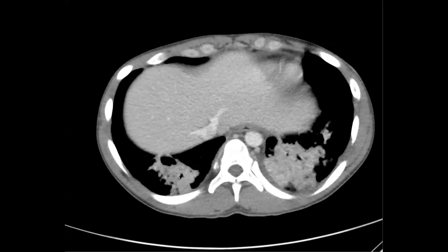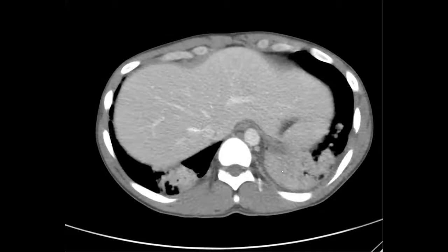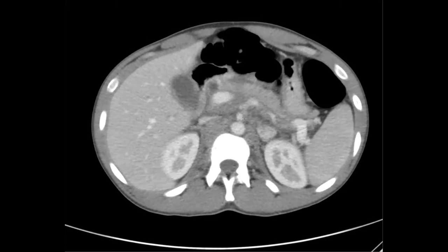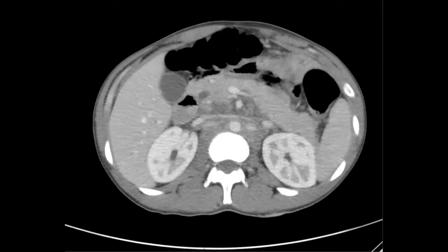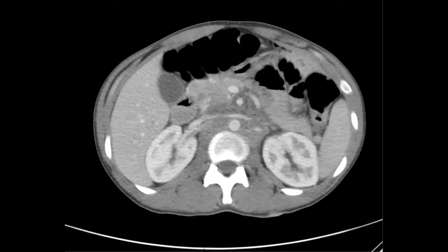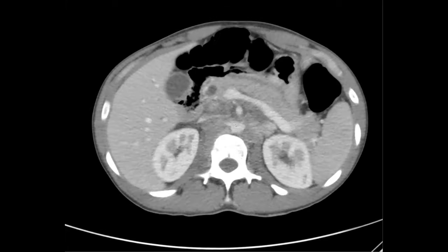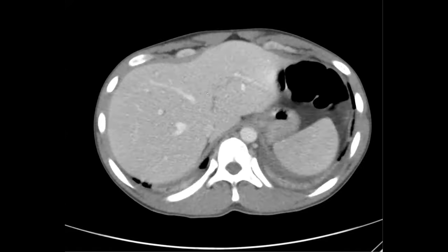Okay. So in the lung it grows in a peribronchovascular flame-shaped appearance, but in the abdomen, it can also grow in a perivascular distribution. I withheld the history; Gathanjali got it. She typed into the chat Kaposi, nice. If you see perivascular soft tissue, I withheld that the patient also had HIV. But this is a nice classic appearance of Kaposi's. You can also see it growing along the portal veins into the liver.